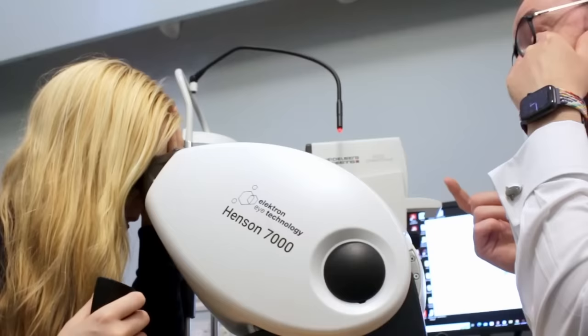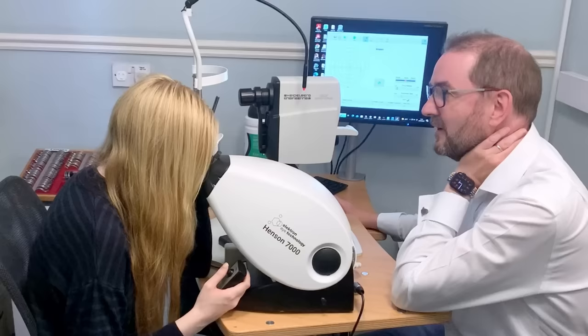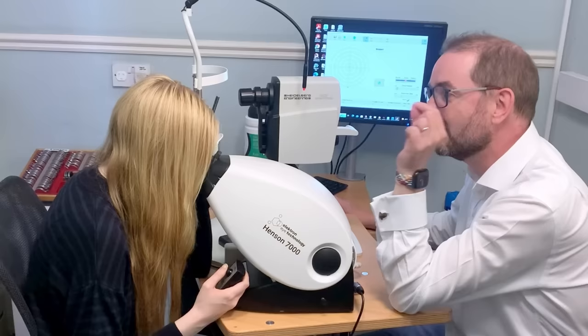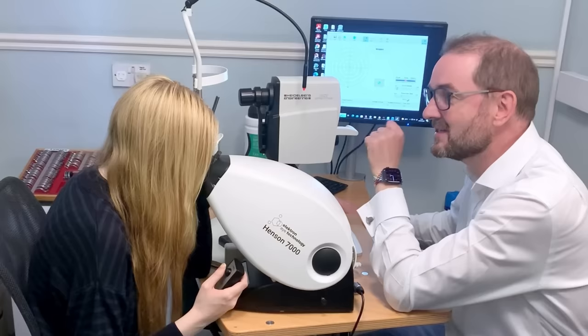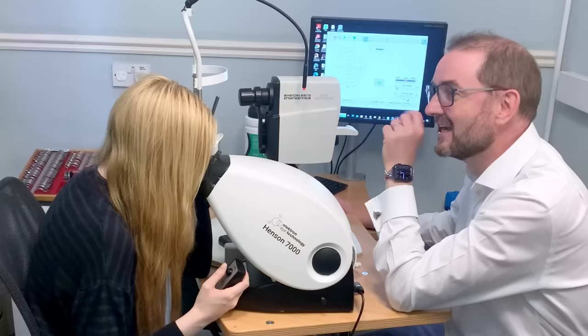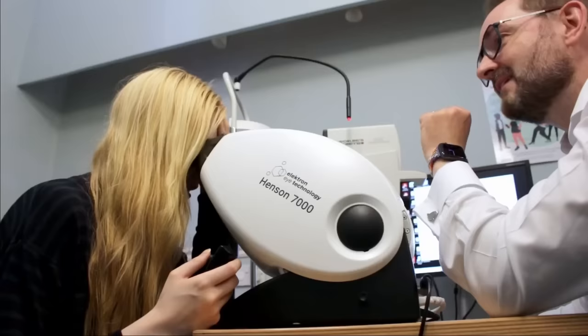You see there's a dot in the middle there. That's a red dot. So you have to always look at the red dot, and then press the button when you see a white dot anywhere else in the bowl. It's only the white dots that you need to press the button for, and there's only ever one white dot, so you only have to press it once. Sometimes you're not supposed to get the dots, so there's not always a dot, so you don't keep pressing it. It tests your blind spot, and you're not supposed to get those ones. It takes about 2 or 3 minutes each eye. Are you ready to go? Okay. There we go.